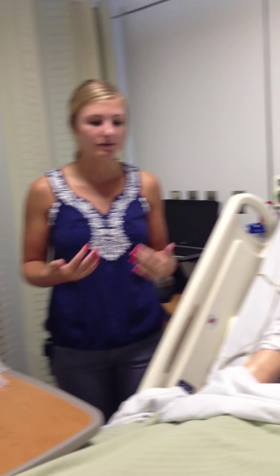I'm Sarah Jungbauer and I'm going to be inserting and discontinuing an NG tube today. For time's sake, I've already checked physician's orders, gathered my equipment, provided privacy, raised the head of the bed to a comfortable working height, put the patient in high-Fowler's position, and washed my hands.